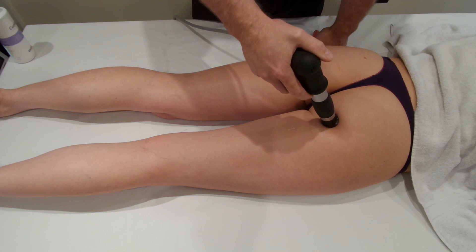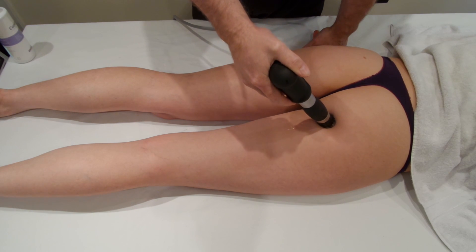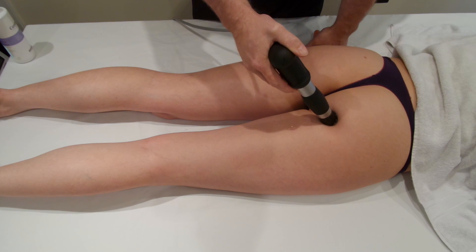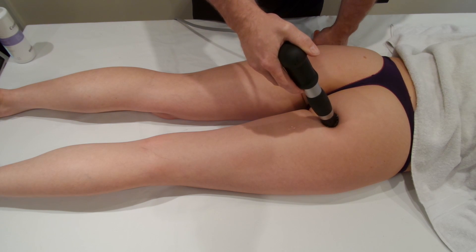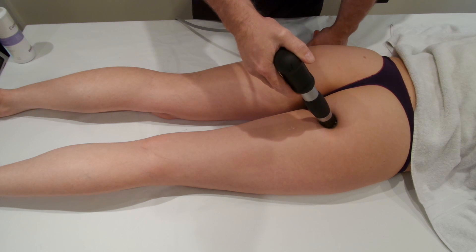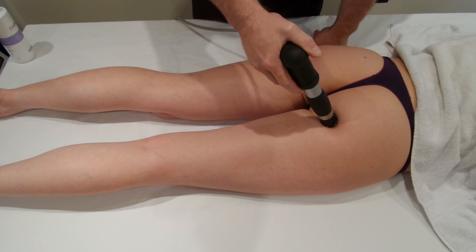Once you get the shockwave going, just work around the origin. Try to get the bone-tendon interface and get the healing occurring at the bone-tendon interface. Sometimes in chronic inflammation the inflammatory process stalls, and this actually helps to get it restarted again.